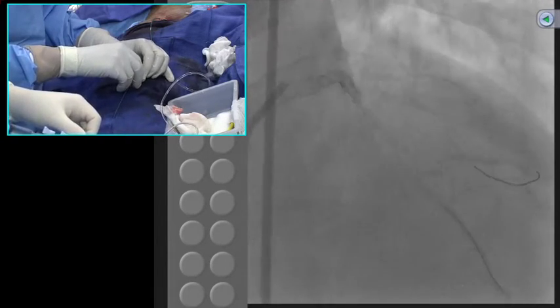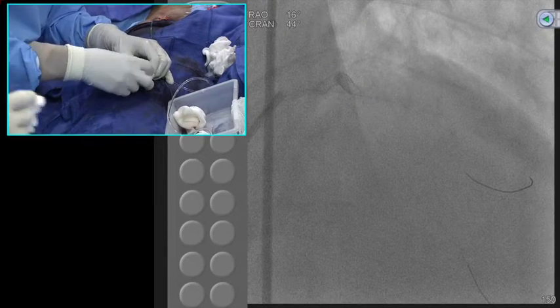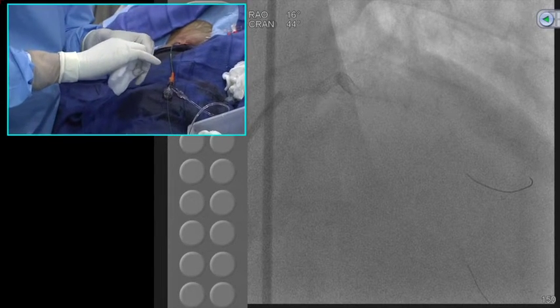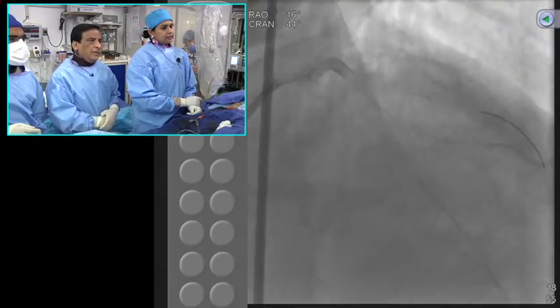Just wonderful skills, rotating, switching the wires around. Yeah, absolutely. So always use double wires, so that if one does not go, the second can help. So back with the 2.0 balloon for the distal part of that? Or no, the question is, let's go back and take a look. No, a 24 millimeter stent will be okay.